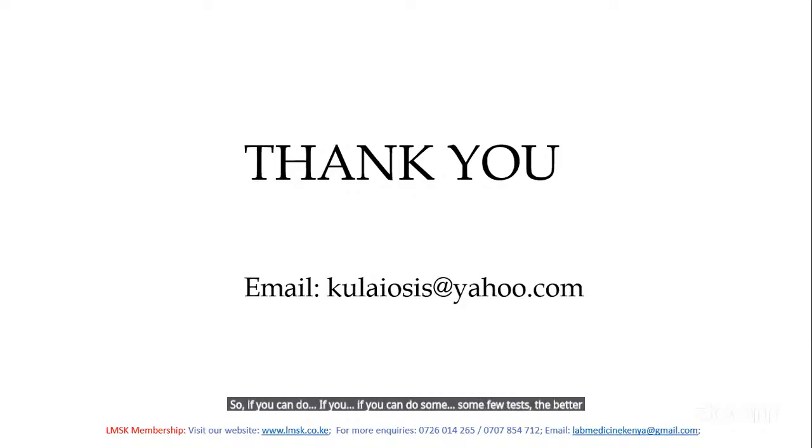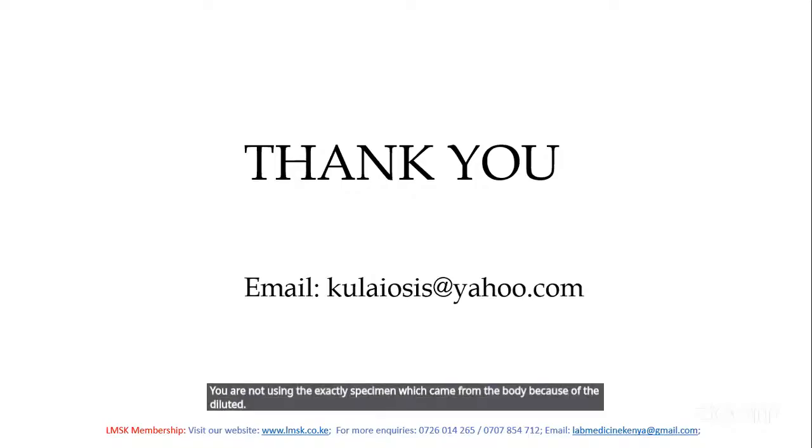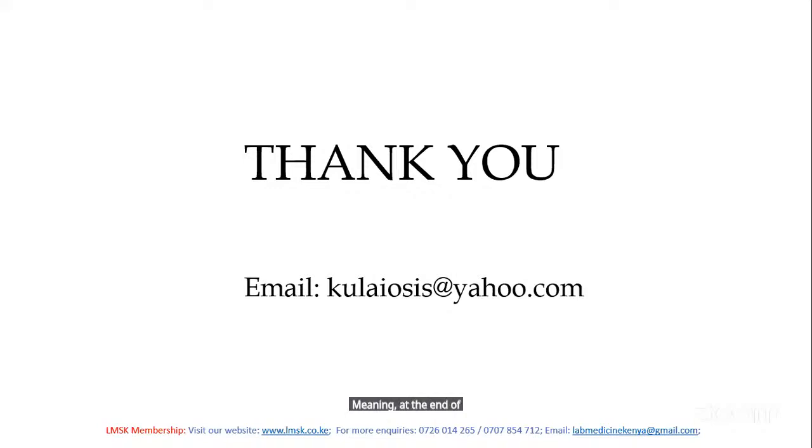But again, you can dilute the specimen. But remember, when you are diluting it, you are not using the exact specimen which came from the body, because it is diluted, meaning at the end of it, you have to multiply with the dilution factor to help you get to the closer, accurate figures. Thank you.